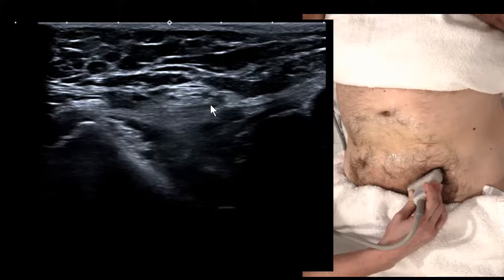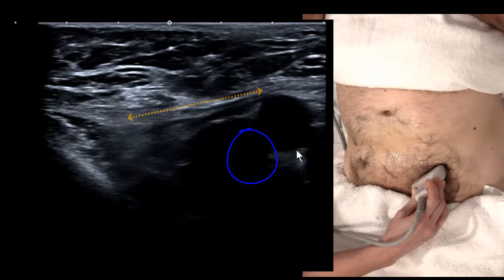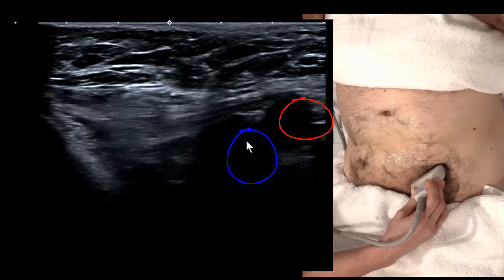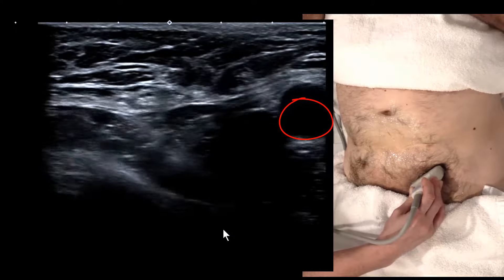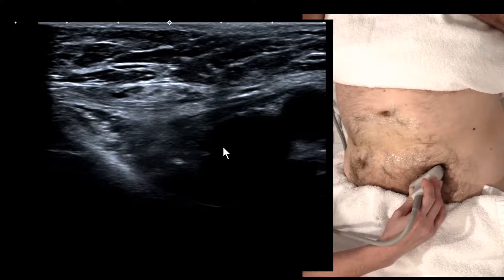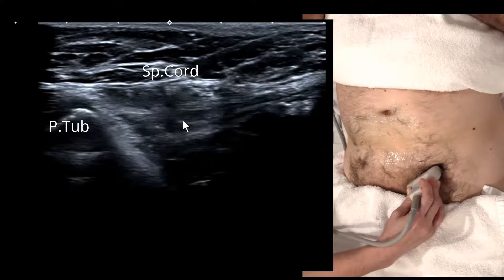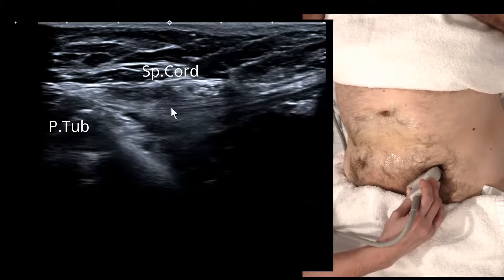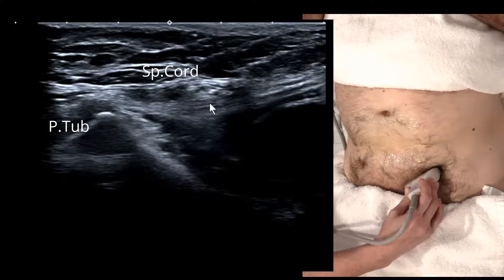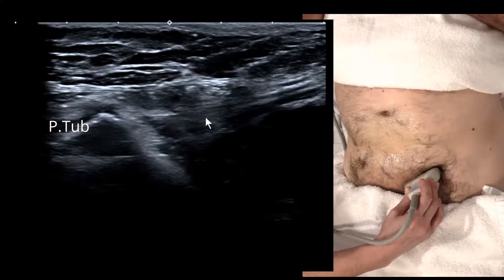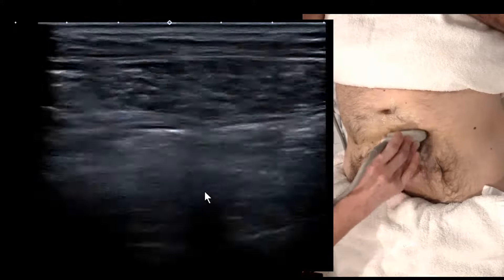The inguinal ligament is sometimes what surgeons stitch the mesh to during surgery. It's passing over the femoral vein and artery. If we're seeing the ligament, we're way too high to be assessing the femoral canal for a femoral hernia — everyone will look like they have a hernia at this level. Once we've identified the inguinal ligament and the spermatic cord, we simply move above this level in a lawn-mowing style fashion.